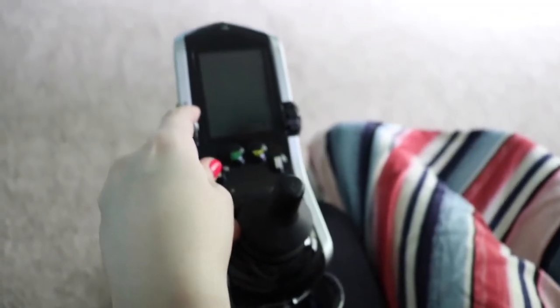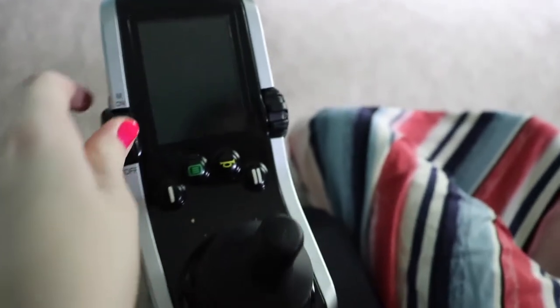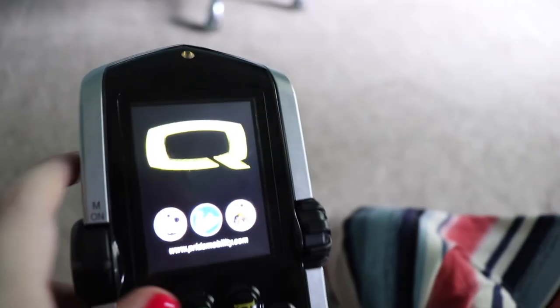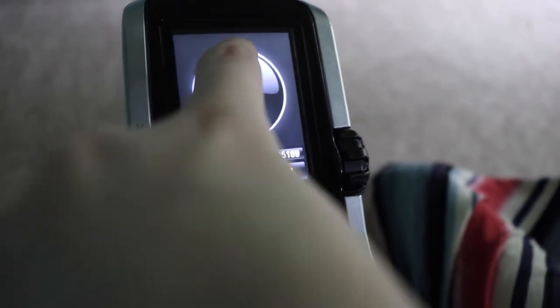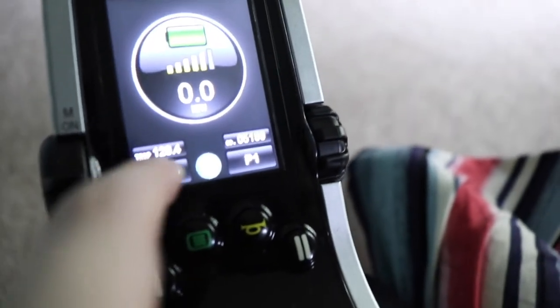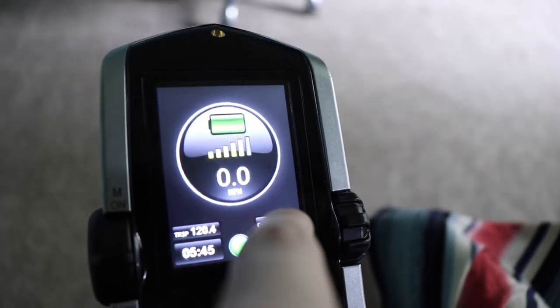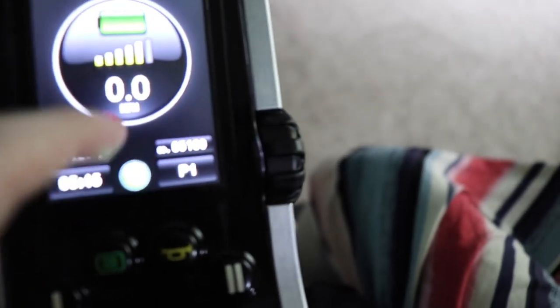It has an on/off button — it actually says 'on' and 'off'. Then it shows the logo, battery, time, and I think that's miles, and then this is the battery. I am dead. My wheelchair is the Quantum Edge. I have a whole video about the process of getting a custom wheelchair.